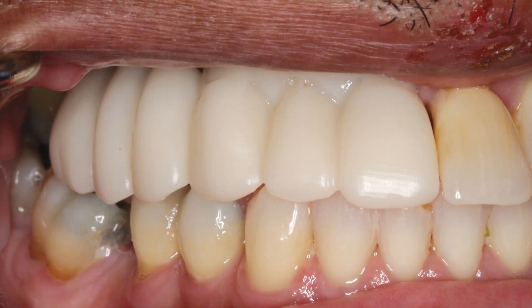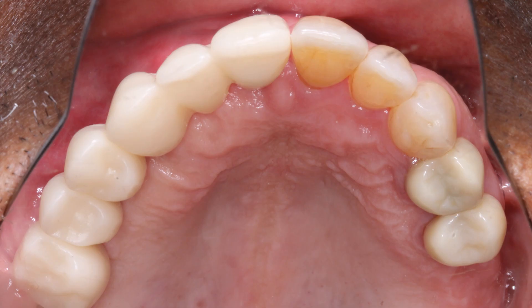I love this process with Glidewell Lab — they created a PMMA try-in prosthesis to help fine-tune the contours and occlusion. This allowed any necessary adjustments to be easily made in the prosthetic design prior to milling the final Bruxer restoration. The patient was involved in this process in making any aesthetic changes to the try-in prosthesis.